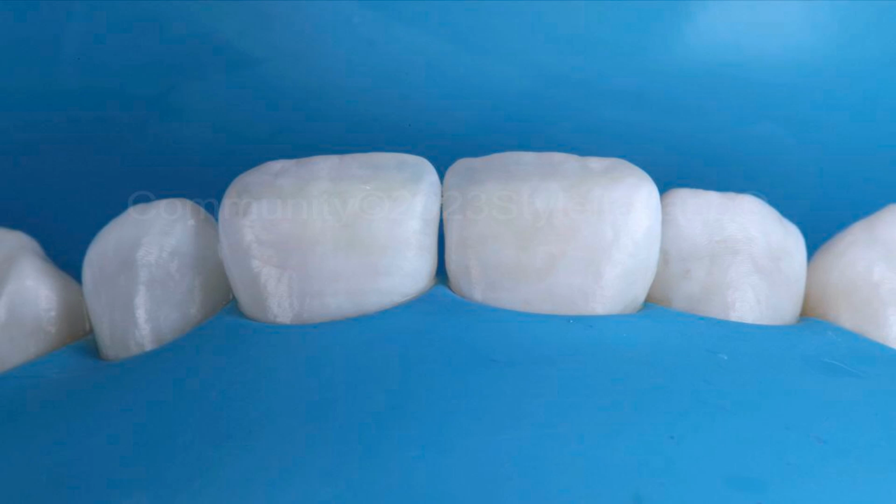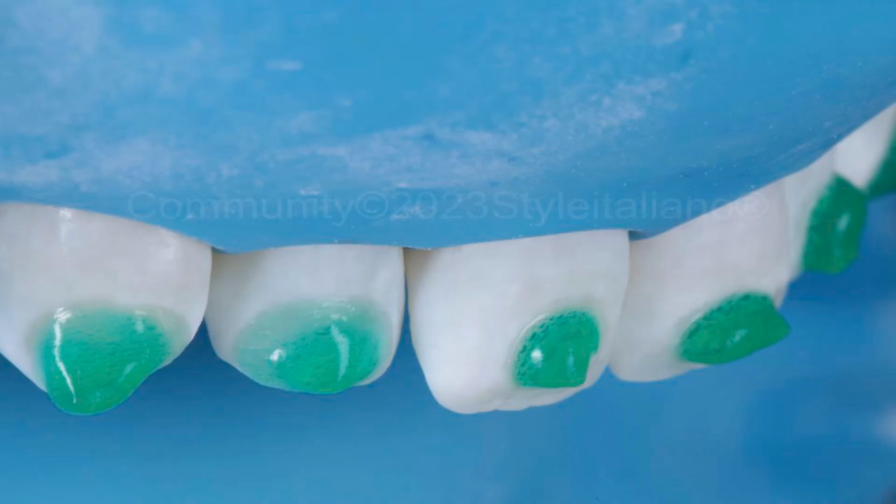After 2 weeks of whitening, the appointment was done, and firstly we do isolation with rubber dam. We use 15% hydrochloric acid for 2 minutes with a gentle scrubbing motion on the teeth.